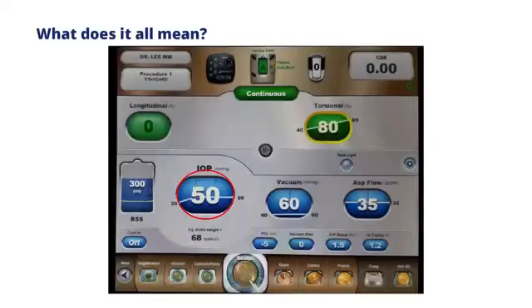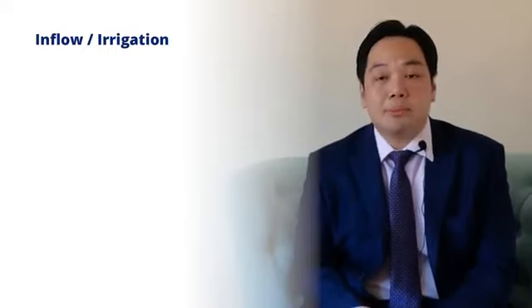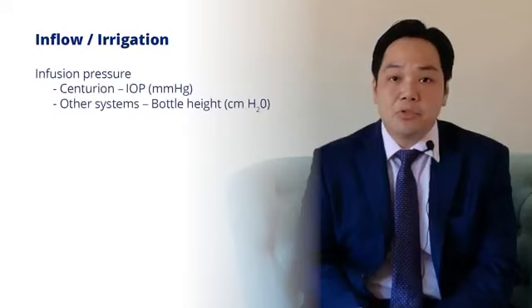So what does this all mean? So if you look at the screen here, the Centurion machine that here I'm referring to, the IOP or intraocular pressure in this setting is 50. And what does that actually mean? Now, this refers to the inflow or irrigation, if you call it, whatever amount of fluid that's coming into the eye, and it's the infusion pressure.